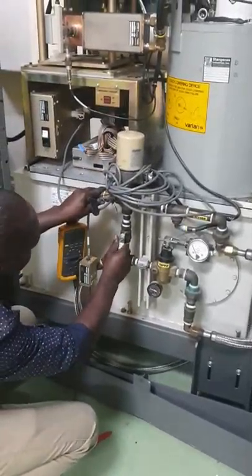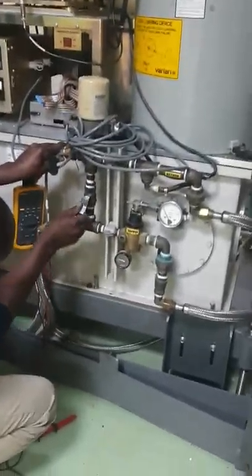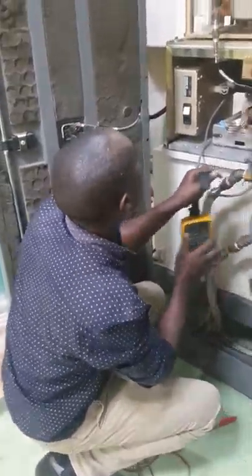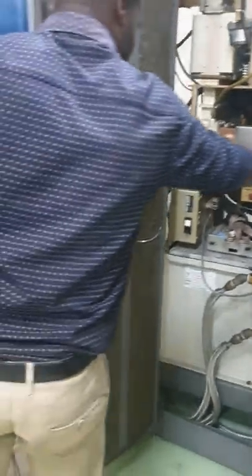He is confirming if the water pressure is okay — yes. He is going to the section for hexafluoride gas to check if the hexafluoride gas pressure is also okay. He is confirming — it's okay there.